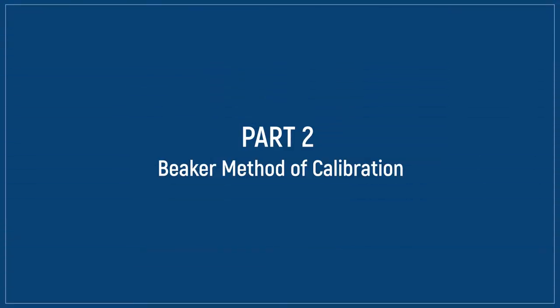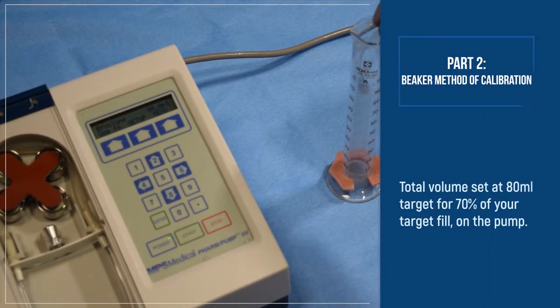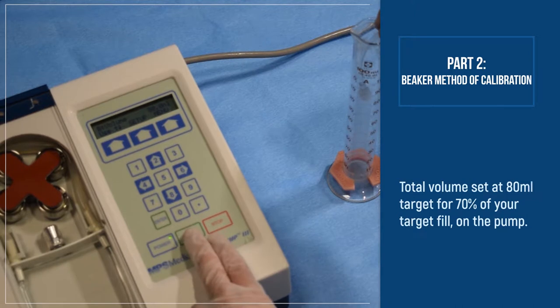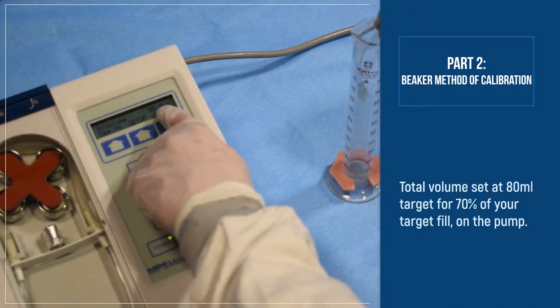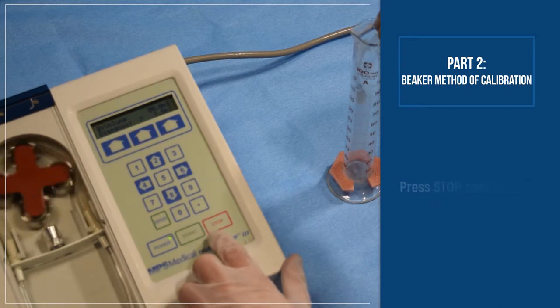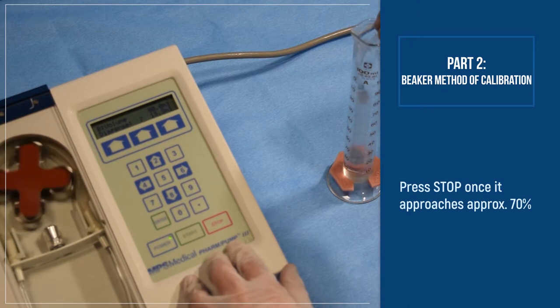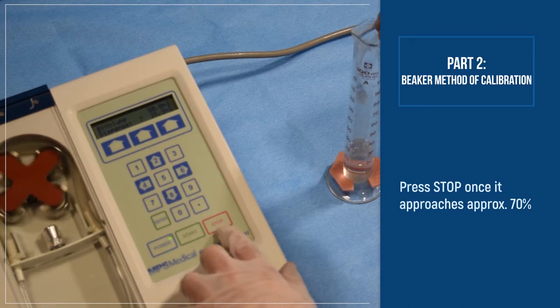Part 2, Beaker Method of Calibration. In this example, we've set our target fill to 80 mLs. For calibration purposes, target to 70% of your target fill for your sample size. Press start. Press stop once it approaches approximately 70%.